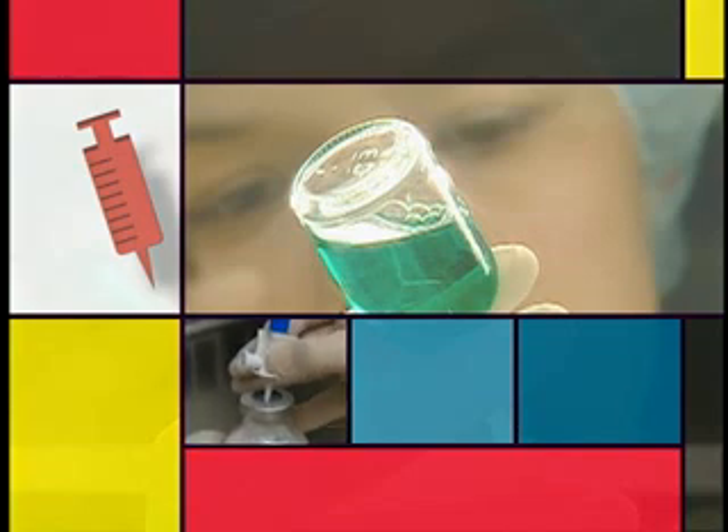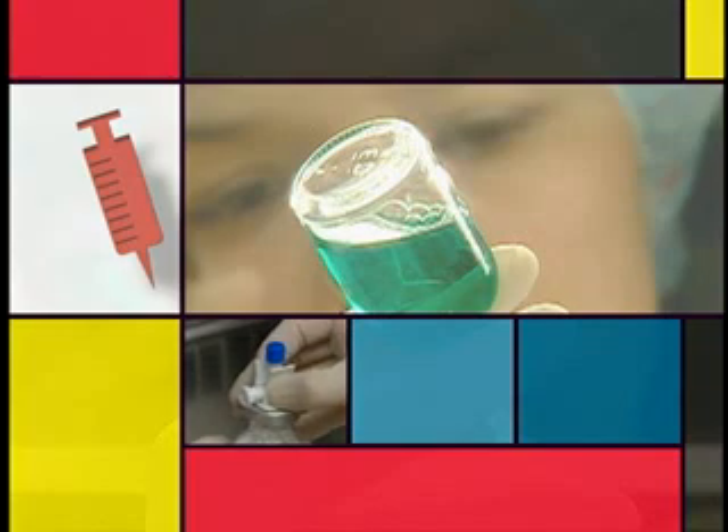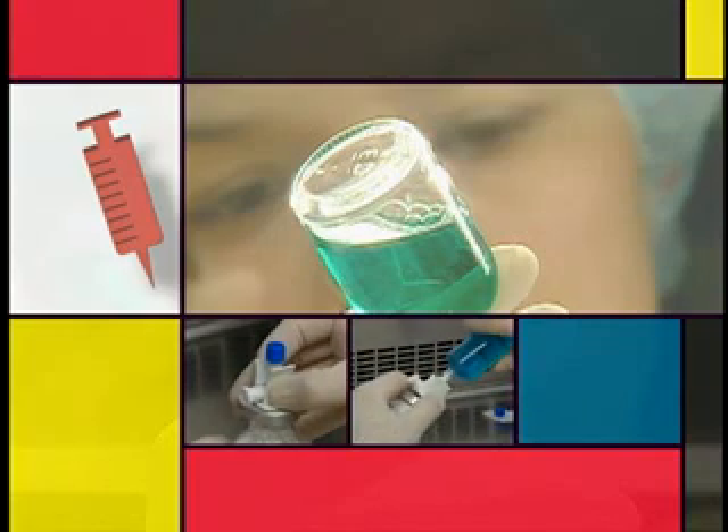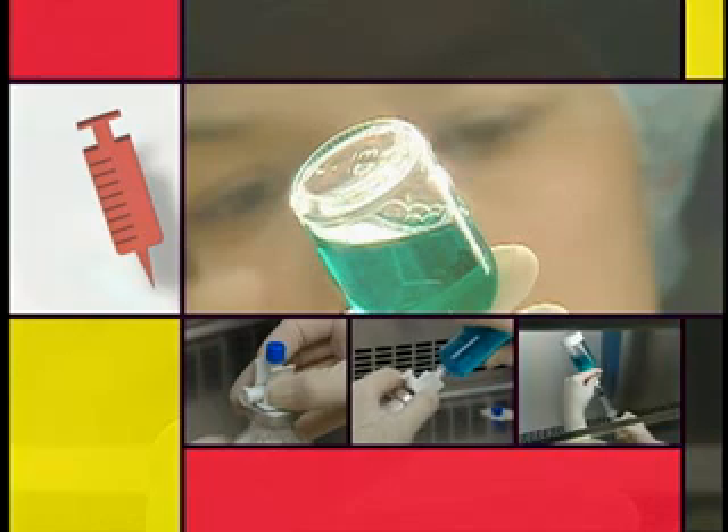The next sequence shows three techniques performed using transfer devices. Such devices are preferred for addition or withdrawal of fluid from multi-dose vials because they minimize the number of punctures of the vial and thus reduce associated risks of contamination.